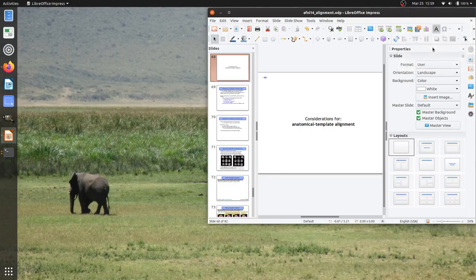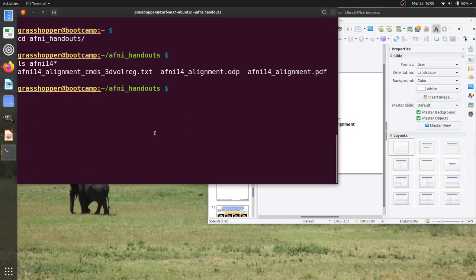In this AFNI lecture we'll be looking at anatomical to template alignment considerations, or more generally, nonlinear warping. This continues a previous presentation on alignment and registration in general. This is using the AFNI-14 handout, which is in your AFNI handouts directory AFNI-14 if you don't have it open already.